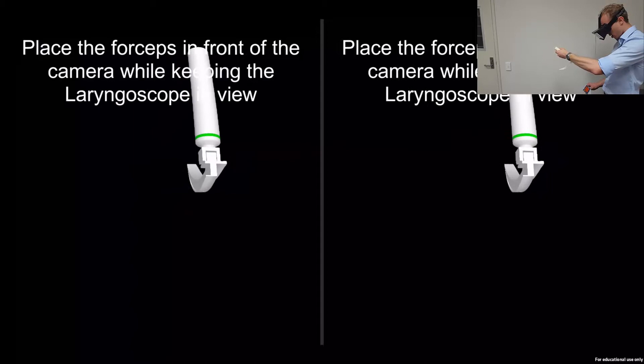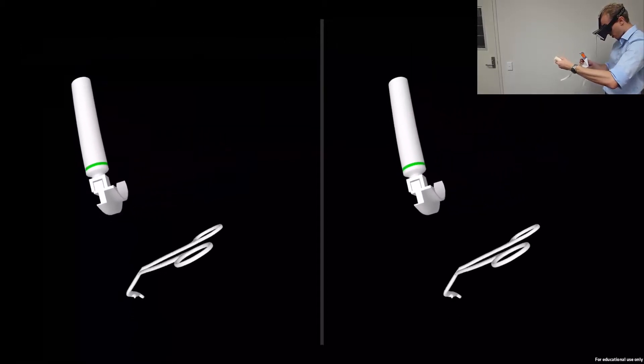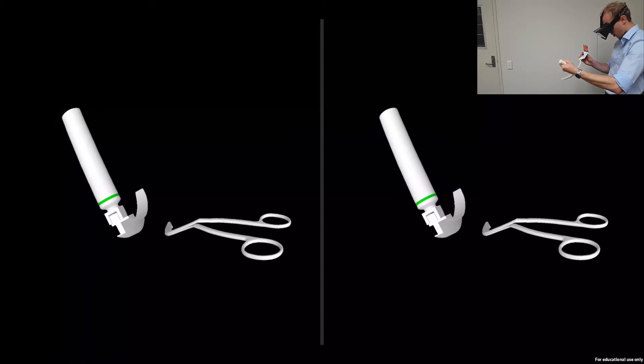Move the laryngoscope. Finally, pick up the forceps and bring them into view. You should now understand how to use this augmented reality simulation, and will be taken into the foreign body removal task shortly.